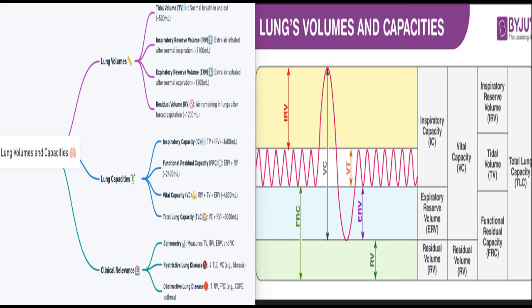So you can think of reduced lower limits or possibly restriction. And when you take forced vital capacity, where you have your value 3.79, the lower limit of normal being 3.01, then you know it's near normal, no significant change.